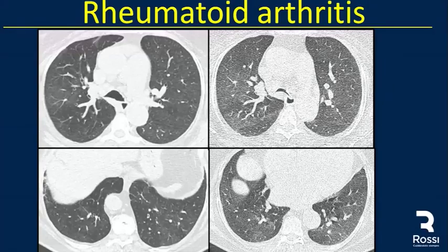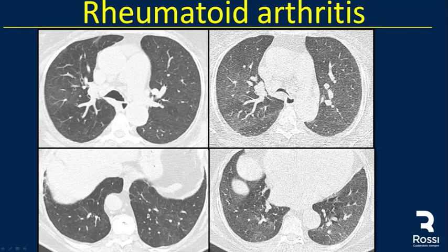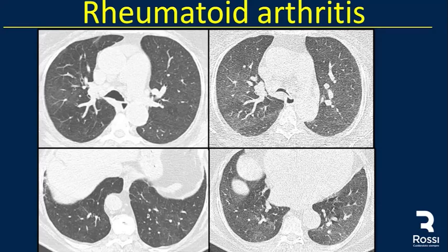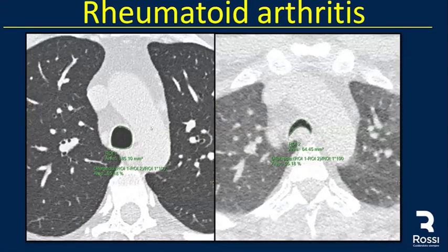Another rheumatoid arthritis case with subtle mosaic attenuation pattern — areas of high and low attenuation. The expiratory CT shows areas of air trapping with diminished vascularity, and we can also see tracheobronchomalacia. The expiratory CT demonstrates reduction in the area of the trachea in this patient with tracheobronchomalacia.